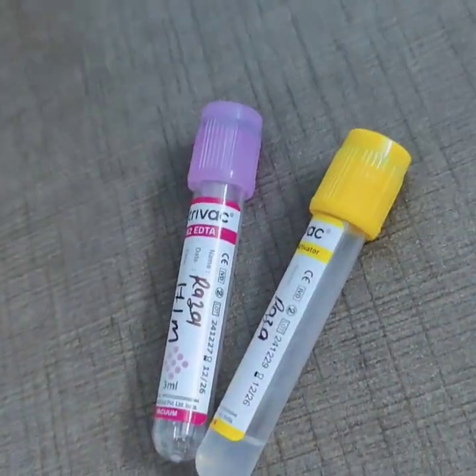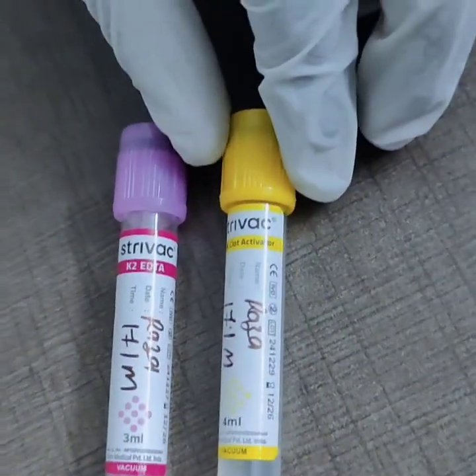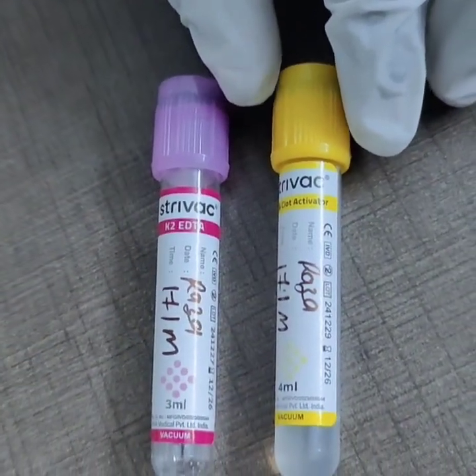Then, wear gloves to maintain proper hygiene and safety. Assemble all the necessary equipment we need.